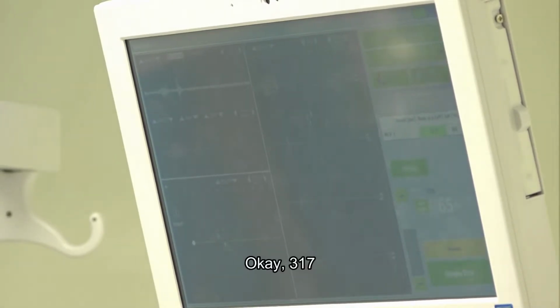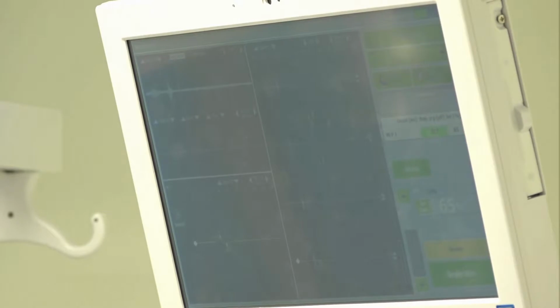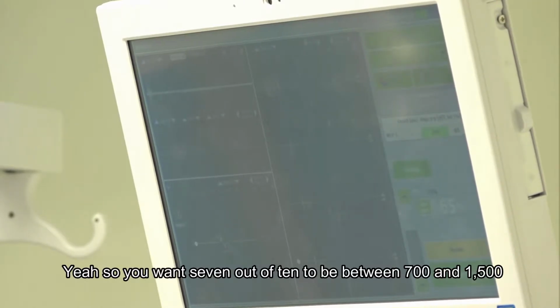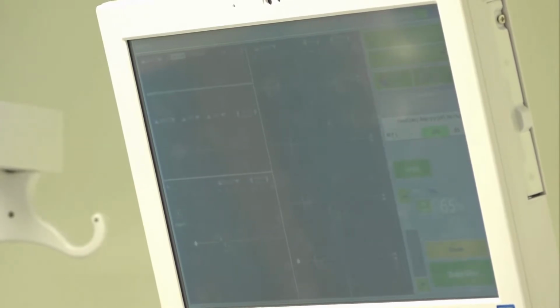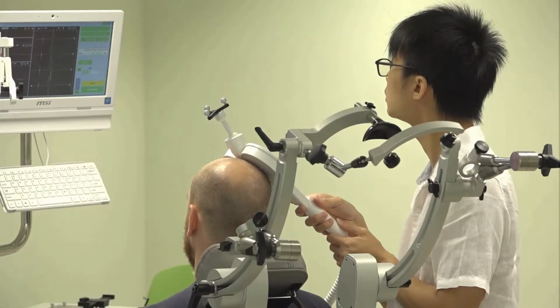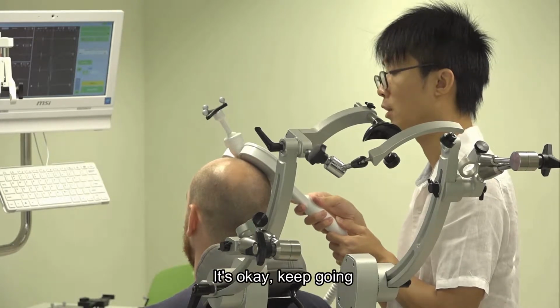Okay, 317. That's what we mean by 7 out of 10. Yeah, so you want 7 out of 10 to be between 700 and 1,500, okay? So if I don't get it, I move a bit, right? That's it, yeah. Oops. Okay, that's okay. Keep going.